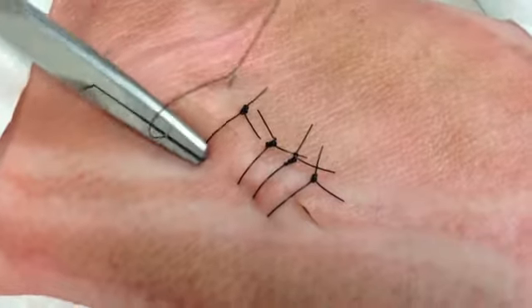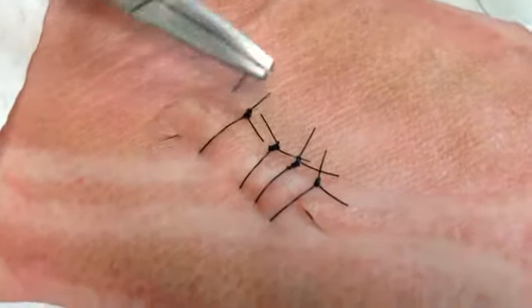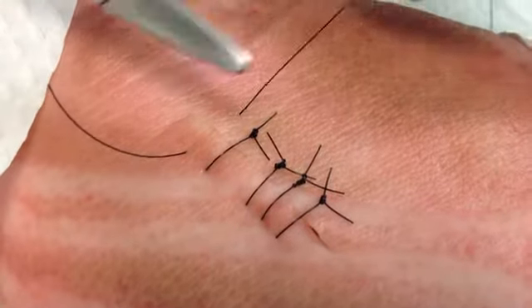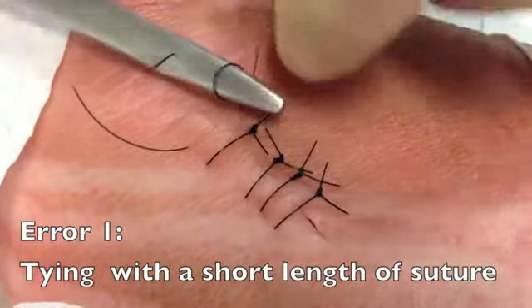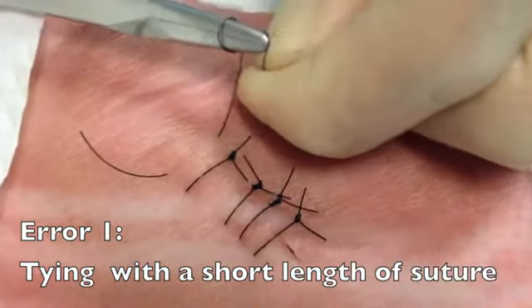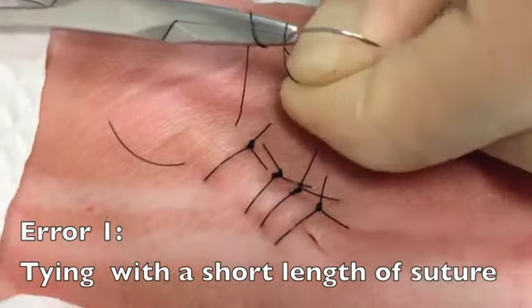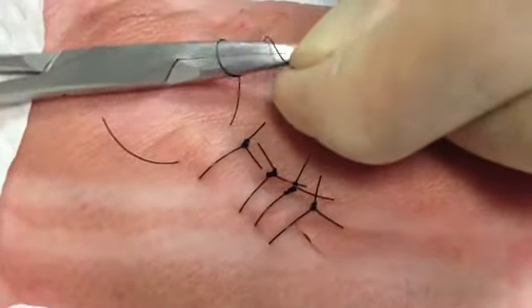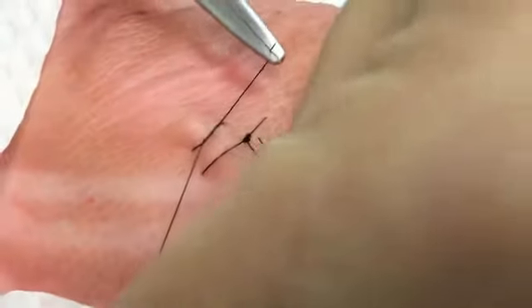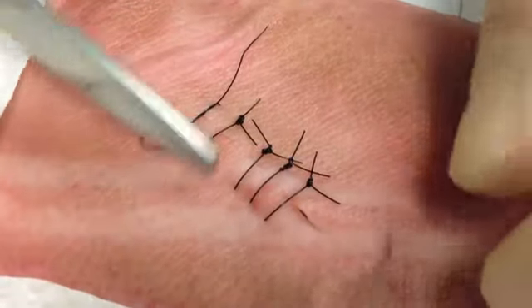The first one is basically trying to use every little last bit of that suture material and just tying knots and cutting until you have this tiny little edge of suture left. The problem with doing this is you're going to have to end up tying real close to the wound. You're going to end up with that needle real close to your fingers. You risk a needle stick injury. It's just not worth it to risk a needle stick. It's better to get rid of that suture and open up a new one when it's starting to run short.